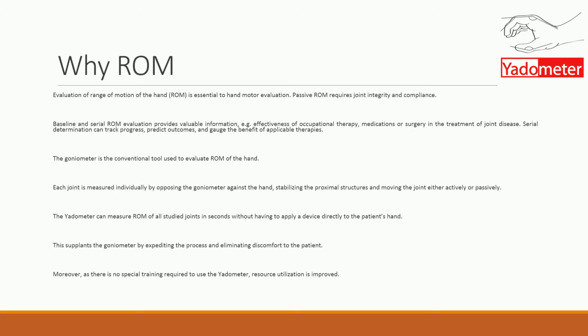action of medications, especially anti-rheumatic or anti-inflammatory medication, progress after surgery, especially in the treatment of joint disease, which can be traumatic or insidious onset from degenerative changes. It can predict outcomes and gauge the benefit of all therapies that are being used.